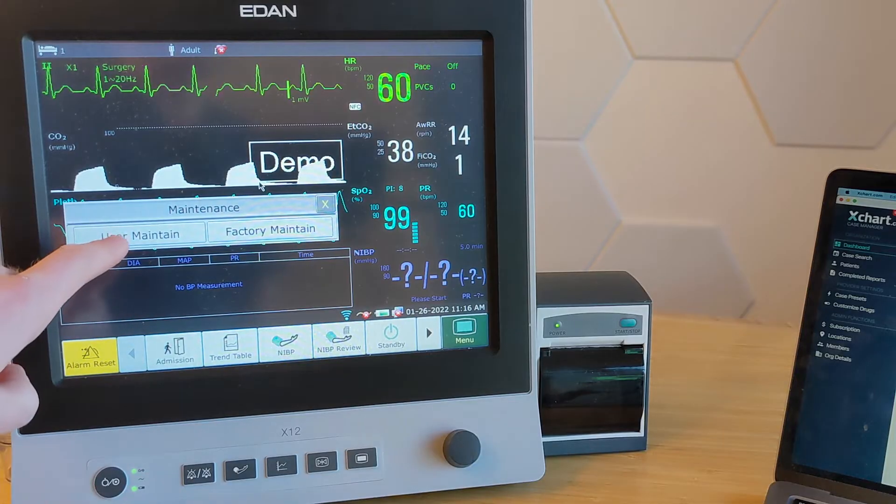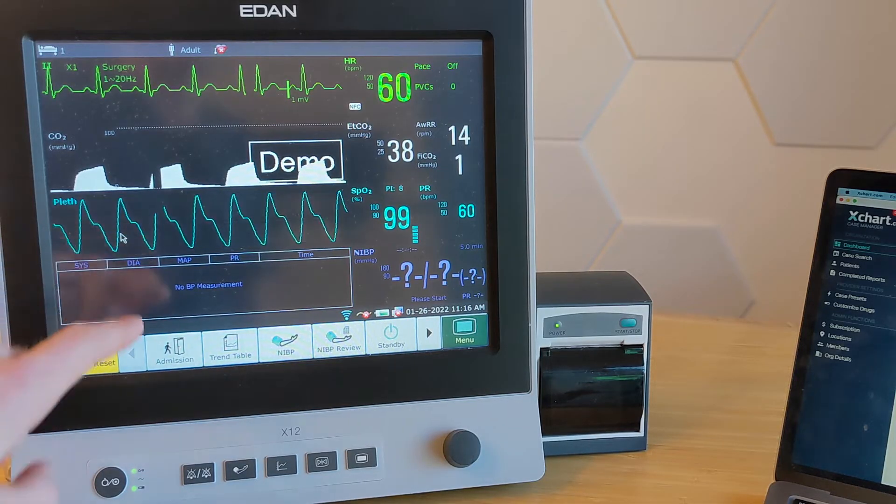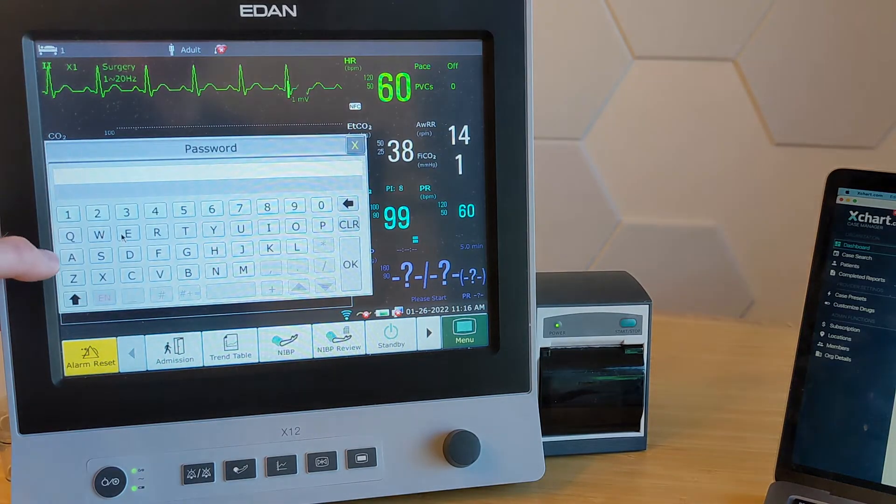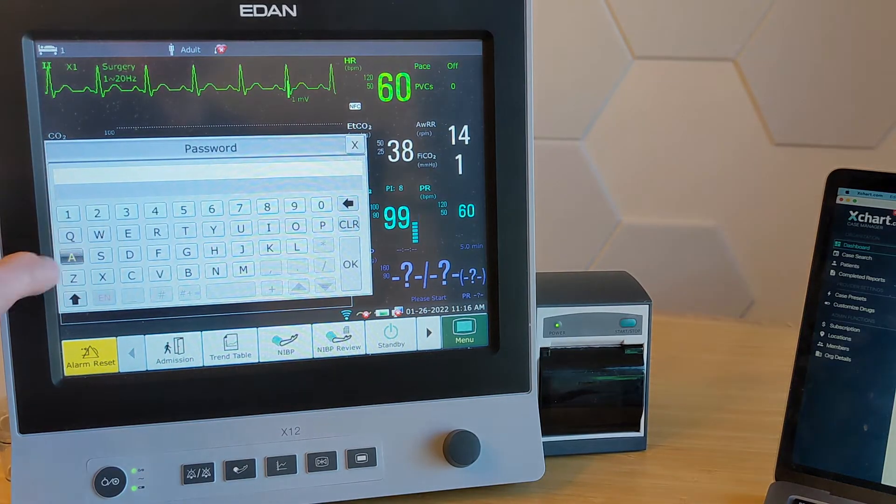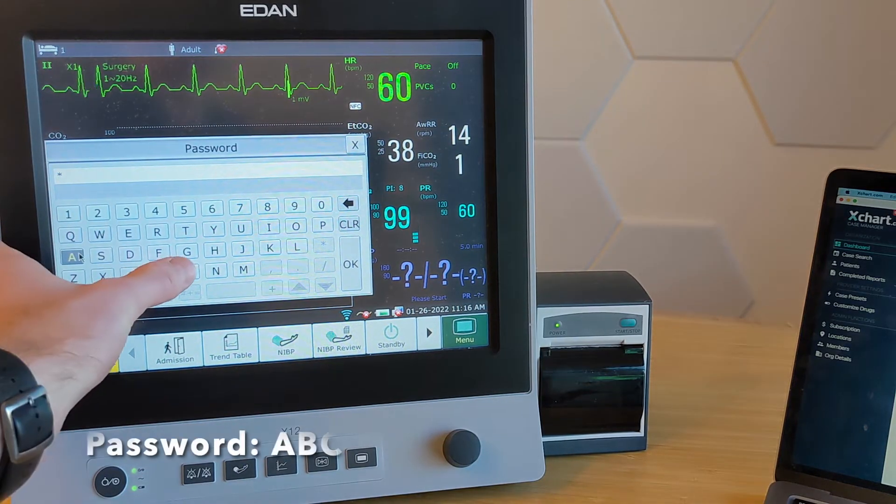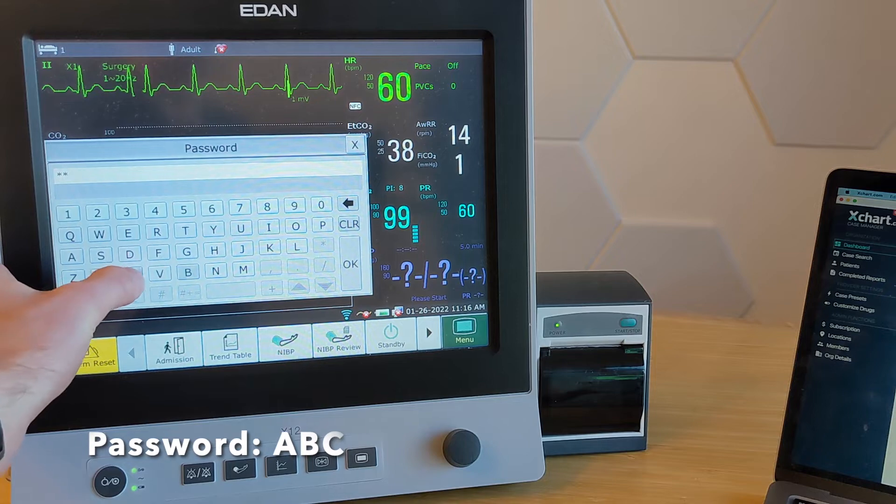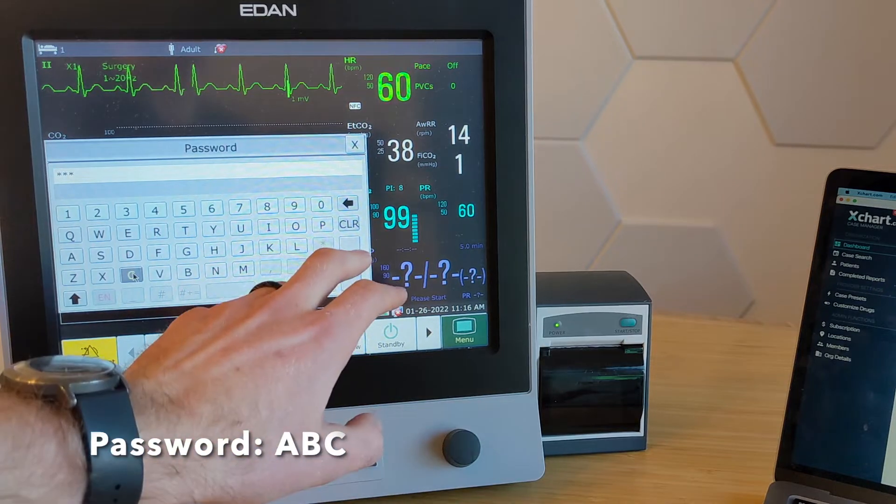And then we're going to hit user maintain, and the default password on these is just ABC, all caps, hit OK.